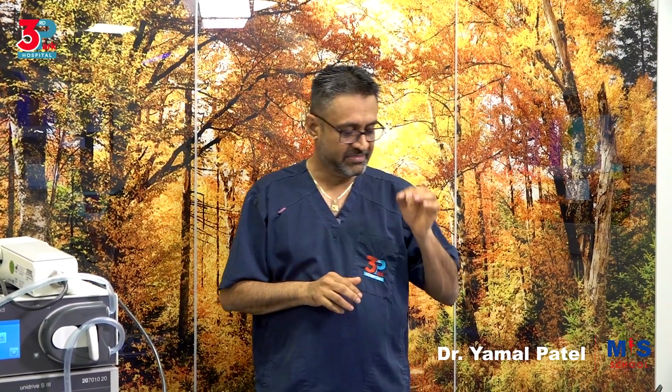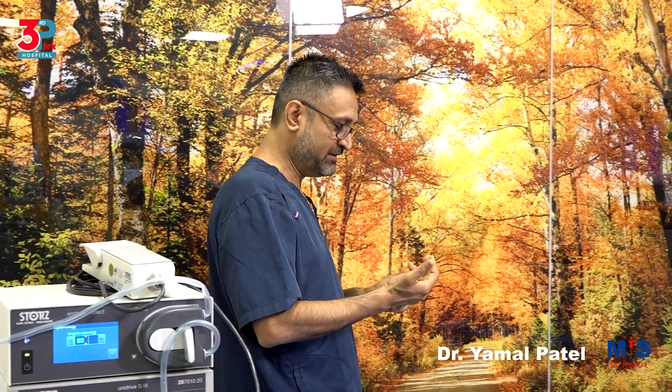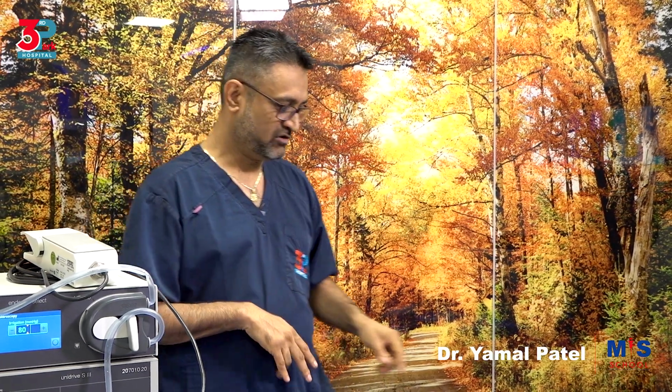And keeping a tab of all this is very important, because the fluid deficit parameters that are important depend on the fluid used, whether you're using normal saline or a hypotonic solution, which determines the maximum allowed deficit. And I think it will be covered in the fluid management talk.